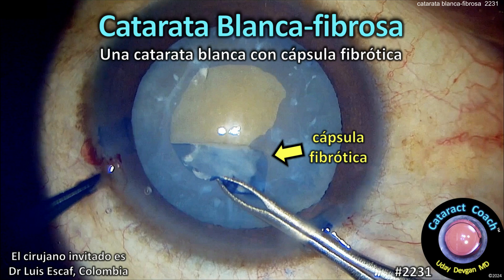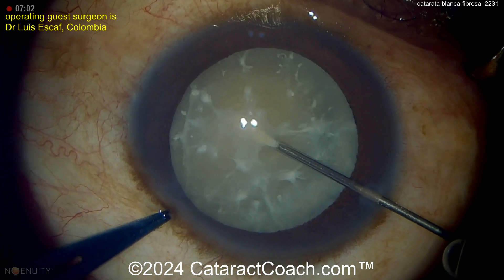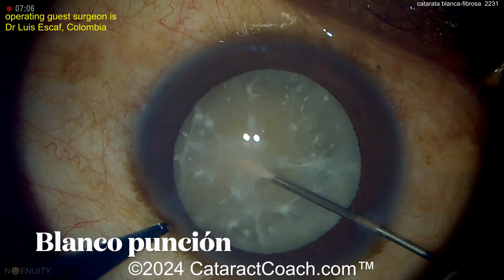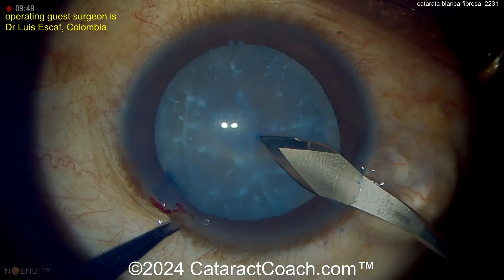CataractCoach.com. Cataracta Blanca Fibrosa — una cataracta blanca con cápsula fibrótica. Nuestro cirujano invitado es el Dr. Luis Escaf de Colombia. Esta es una cirugía de cataratas difícil. La cataracta es densa, pero también la cápsula del cristalino es fibrótica.